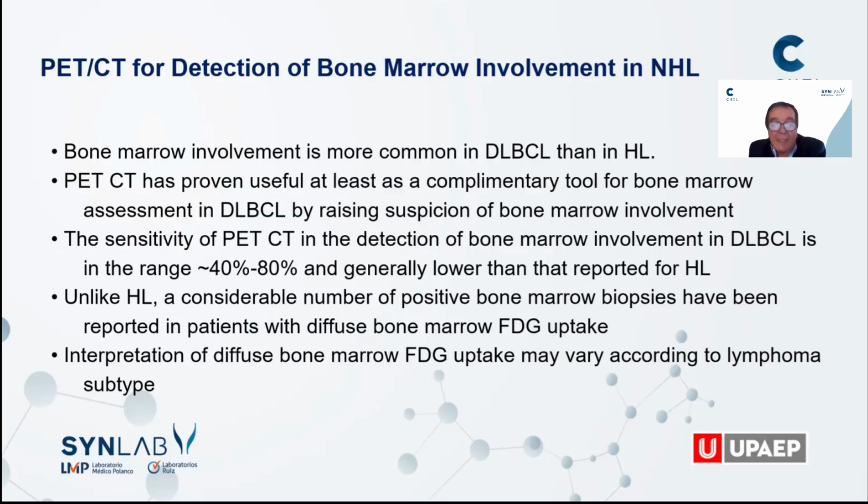On the other hand, in non-Hodgkin lymphoma, bone marrow involvement is more common. Unlike Hodgkin lymphoma, positive bone marrow biopsies were found in more PET-CT negative scans.